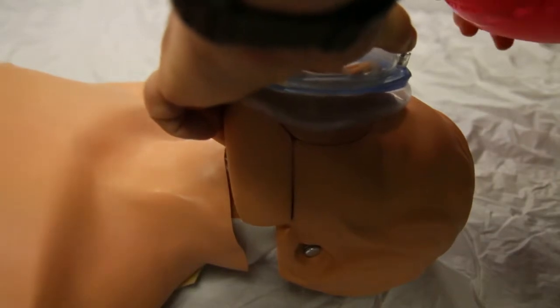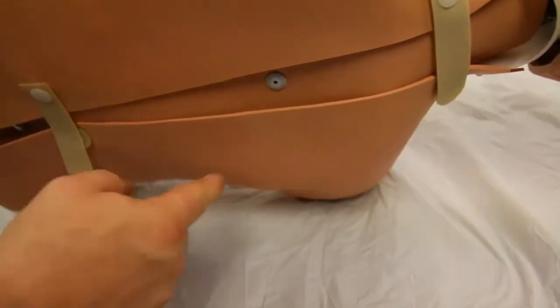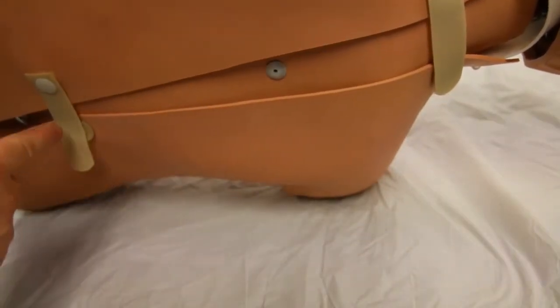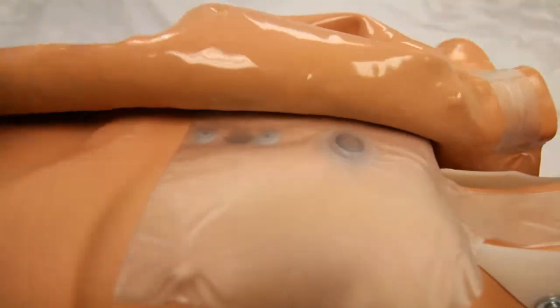Operation of the unit with BVM. Note chest rise. To replace the lower portion of the lung assembly, open the skin overlay and slide up over the shoulder. This exposes the lung bag and connection to the airflow sensor.